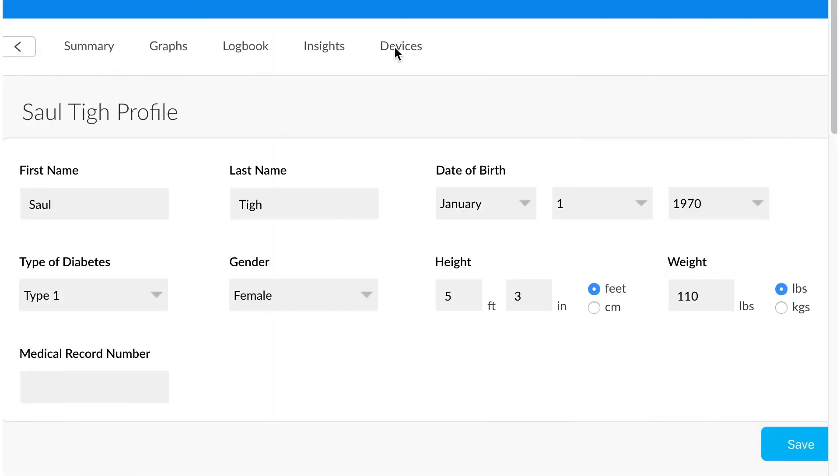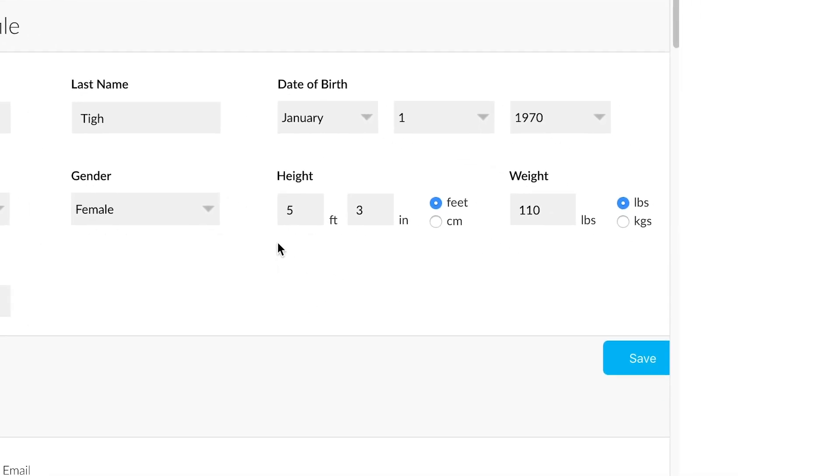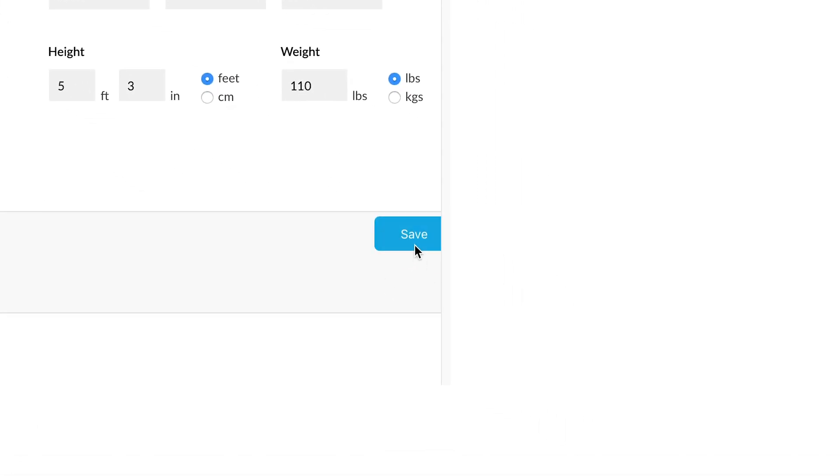From the patient profile, you can edit the name, date of birth, type of diabetes, gender, height, weight, and you can modify a medical record number or add one. To make the change stick, you'll just push the save button over here.